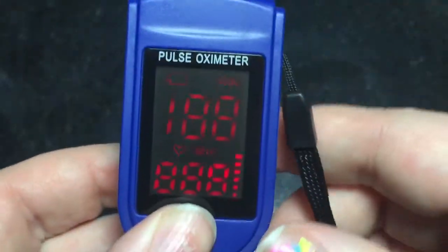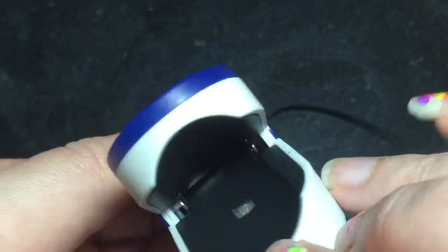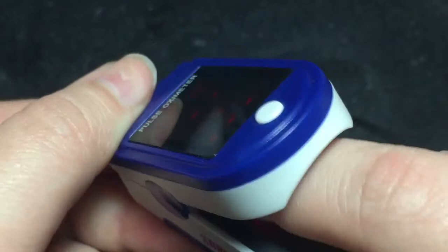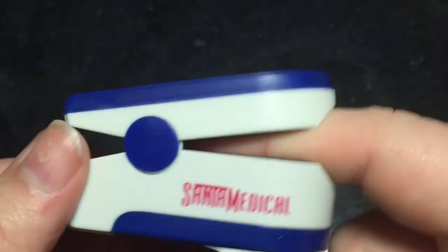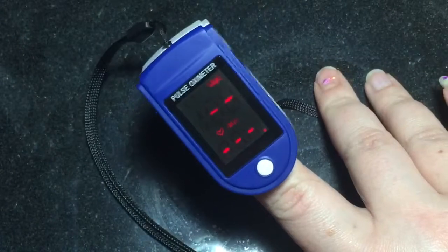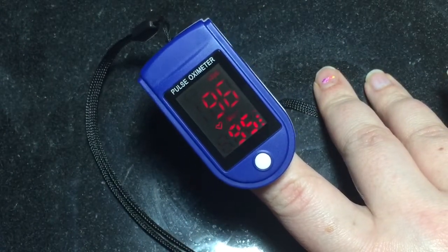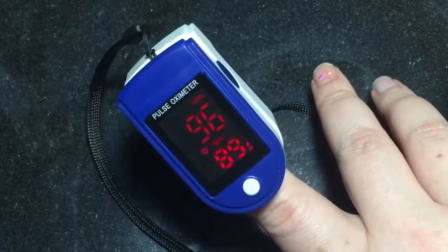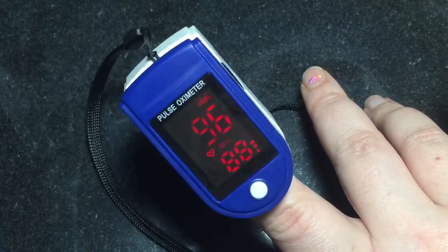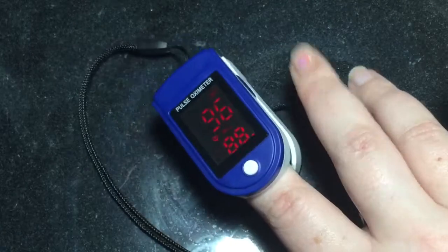You can actually wear this on your neck. It's pretty simple to use — you just use this button and turn it on, open it up, you see the light there, it's very soft on the inside, and then you just keep your finger in there and it gives you your results.